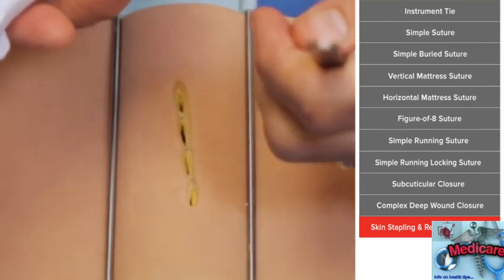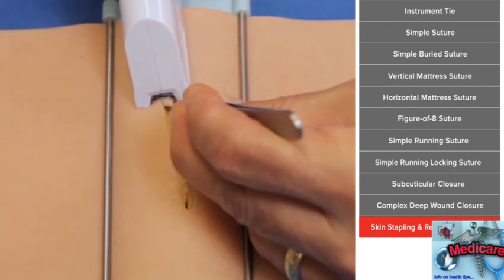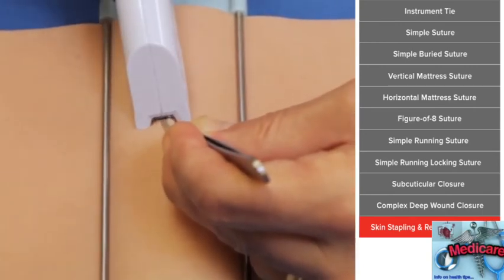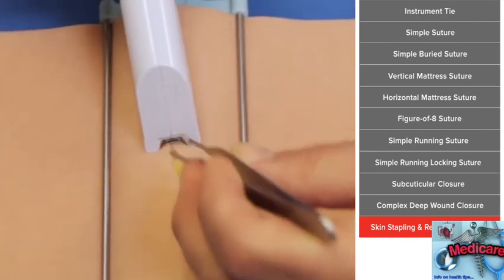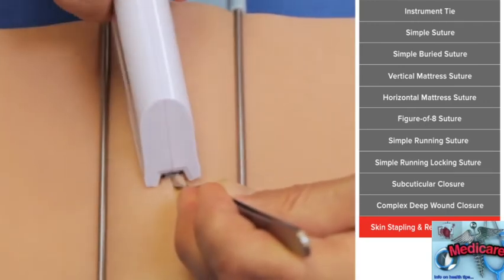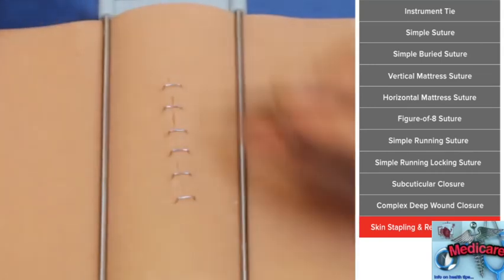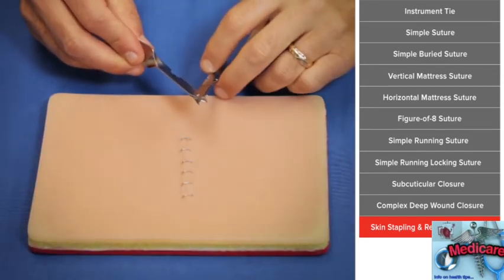I think a very controlled motion is key, that when you're stapling, the end of the stapler is not really moving at all. Try to grab it near the end of the stapler, you'll have more sort of torque advantage. And again, just like simple sutures, you have to decide how many staples you need and what each wound needs for approximation. In a case like this, if this were a complex wound, we have multiple layers of closure, a staple might be nice because I'm going to leave these staples in for a few weeks. And generally, where sutures can get infected, metal staples do not.